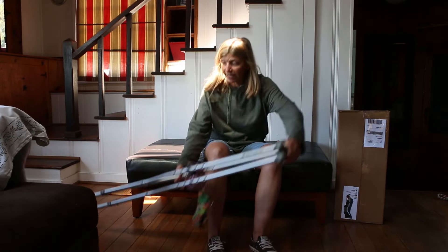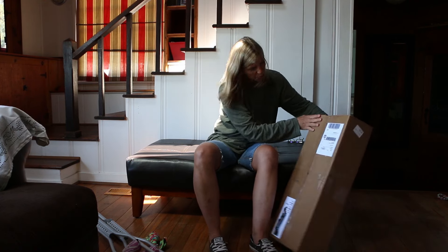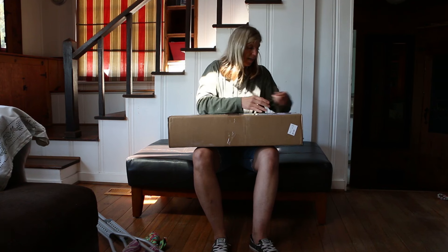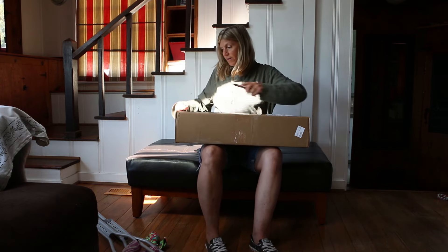I'm ready to throw these crutches away. I've been on them for four weeks and my wrists are super sore. So I just ordered something called the Freedom Leg, which is supposed to allow hands-free mobility. This is my unboxing of it.